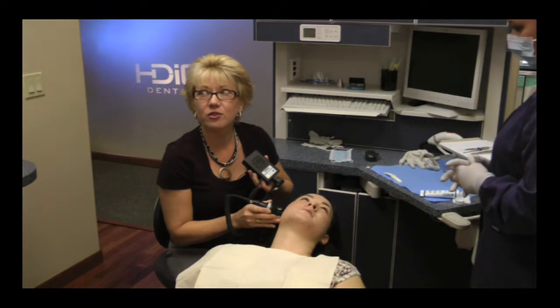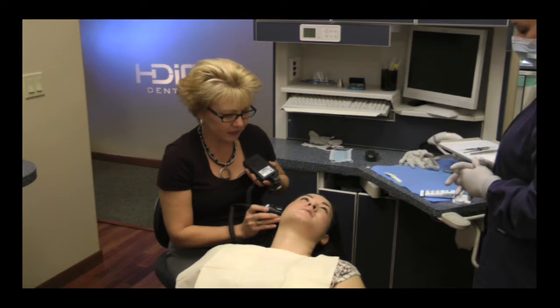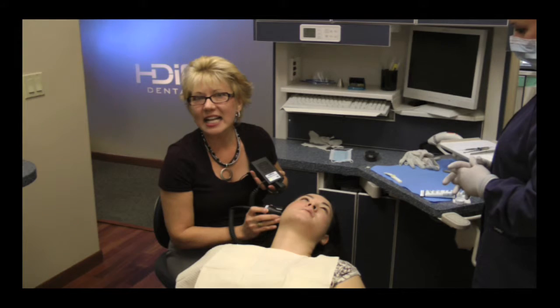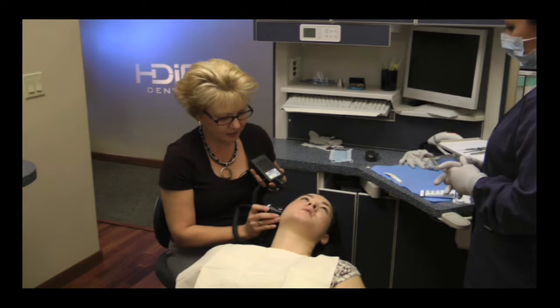And now I can hear her superficial temporal artery. That tells me I'm in the right place. So now what I'm going to do is tip the Doppler forward until I lose the sound of the artery. And I'm going to ask Katie to open and close 3 times so I hear a lot of scratching so that I can get to the loudest spot. Go ahead and open really fast for me 3 times.